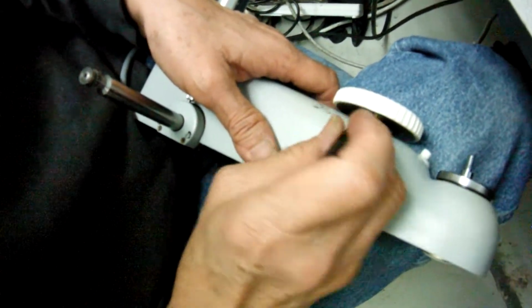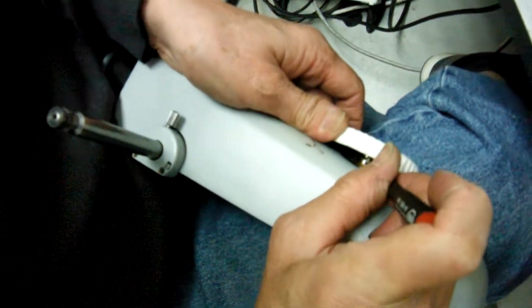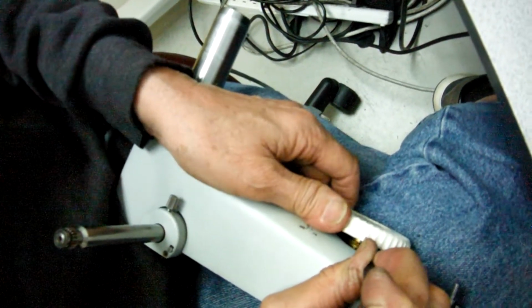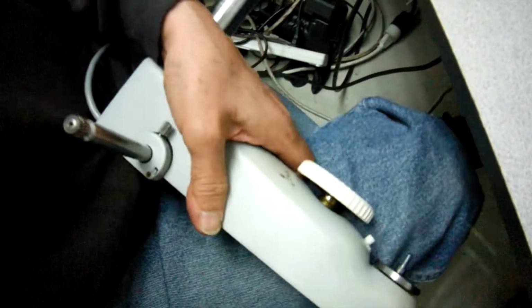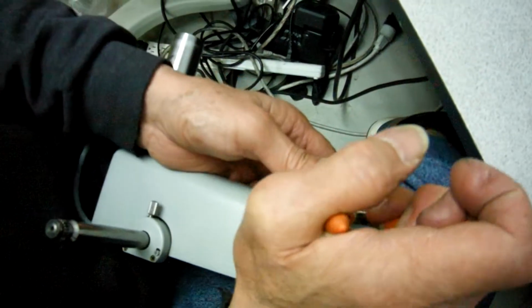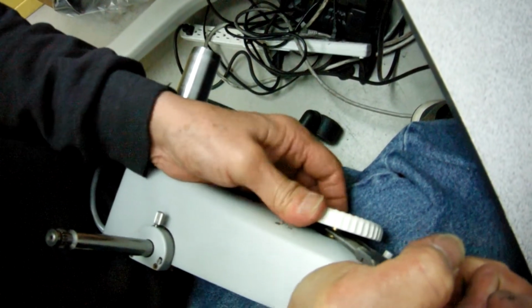You see it's still got a gap in here. So what I do is I use this screw to hold it in place, and turn the nut. And like I said, you might need a real thin blade pair of pliers, and just grab the hole there, and then just screw this knob in there as far as it can go.